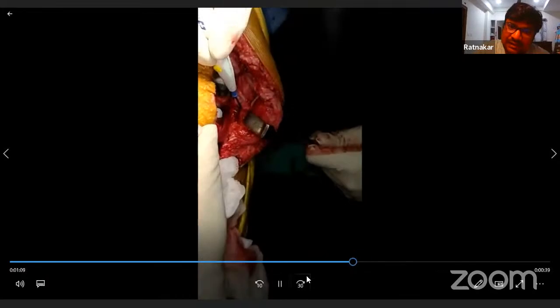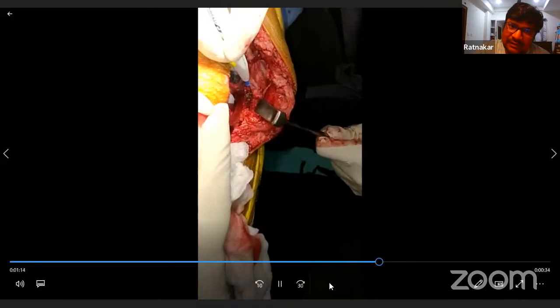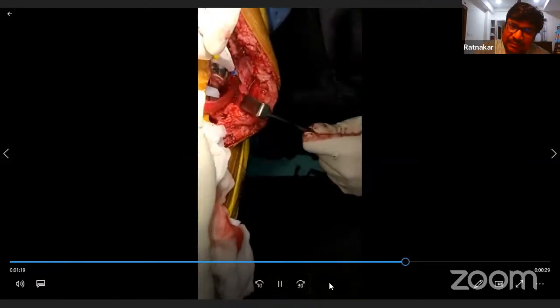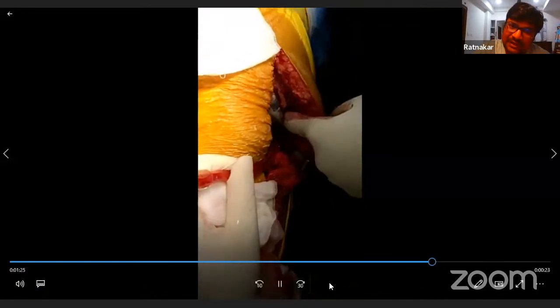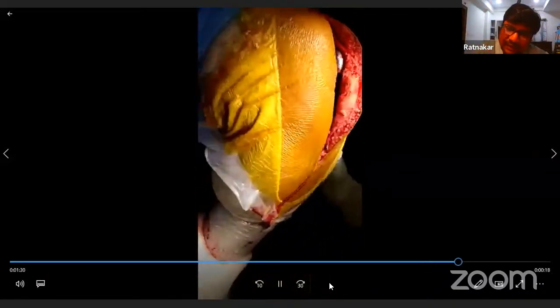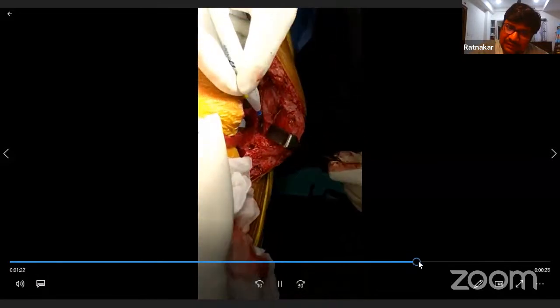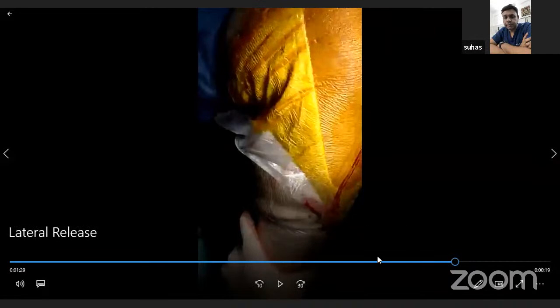Yeah. So this is about that lateral release. So that is the patella lateral border. 1 centimeter from that, you are just releasing it. This is going from the midpoint of the patella proximally. And like Dr. Kushal was telling, the other thing is that if you want to extend from the midpoint of the patella, you can come down to the tibial plateau also. You can appreciate this one? So this is the left knee.